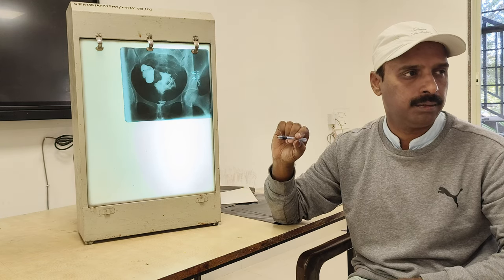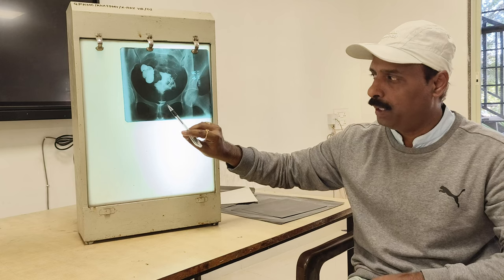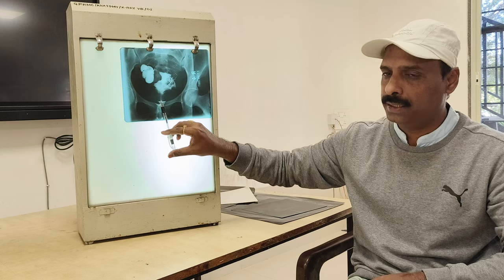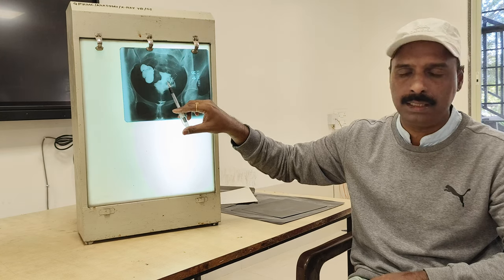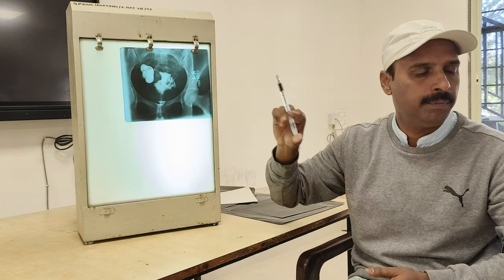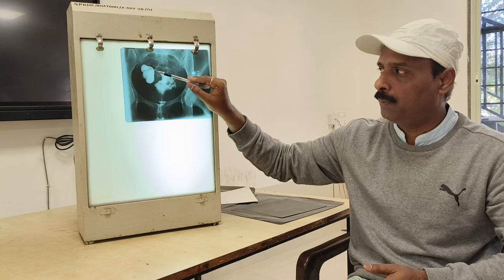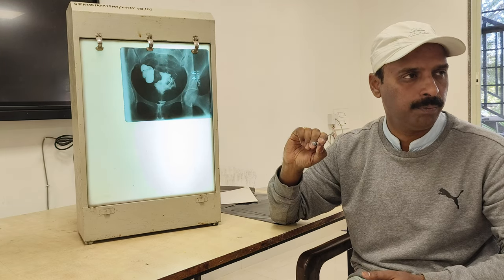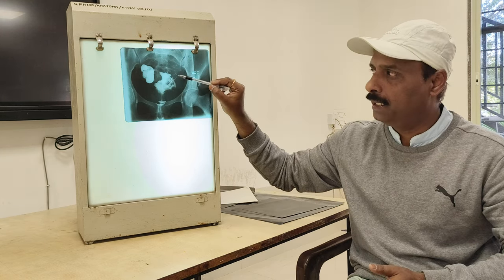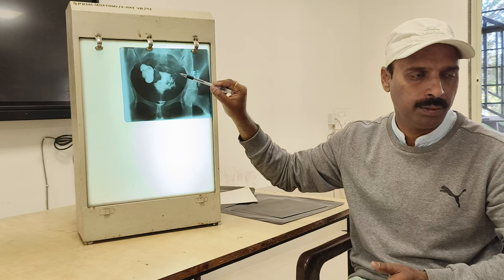We do these types of X-rays to check the patency of the tube. We enter through the genital tract up to the cervix. After the cervix we inject the dye into the uterus. If the dye reaches the fimbrial end of the uterine tube on both sides, then the tube is normal and not blocked. But here the dye has not gone to the left side. You don't get this type of image on the left side, so we get left tubal blockage here.